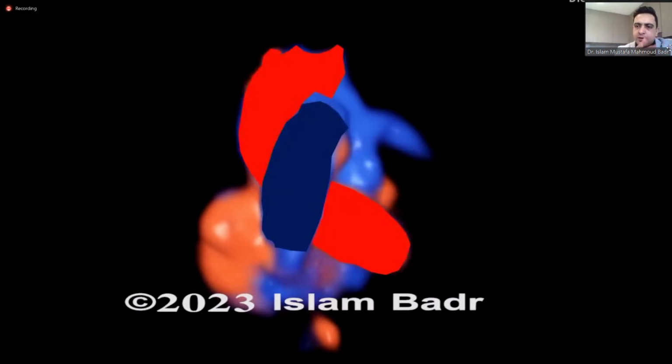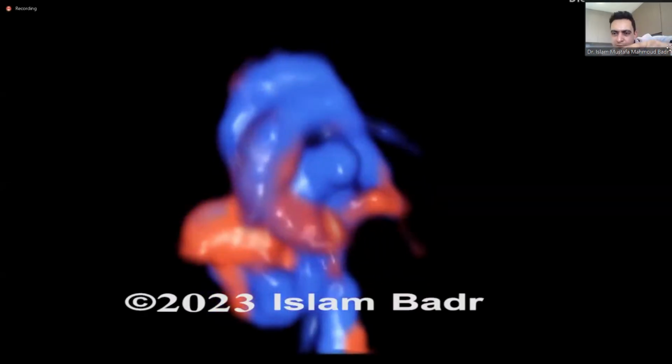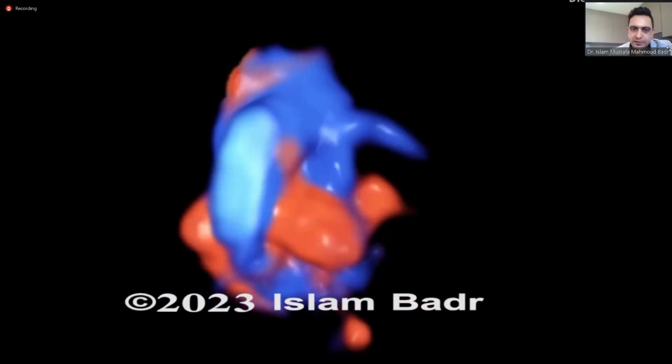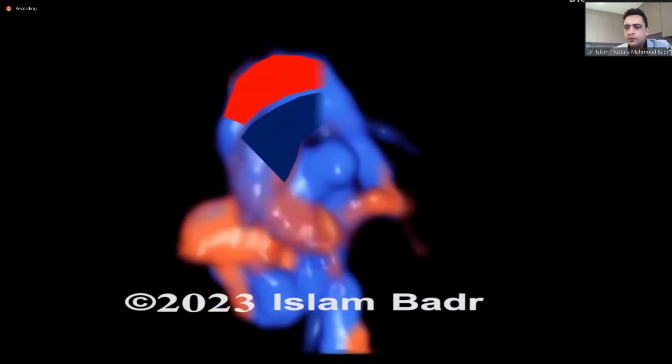Now we will start to see the heart from the lateral aspect. See what will happen? They both come to be parallel with each other distally. You will see the parallel connection now. I will label it. When you see this parallel orientation distally in a normal heart, what we call the V sign, don't misdiagnose this case as TGA, because you will have everyday normal cases misdiagnosed as TGA. This is just a V sign. This is just the parallel orientation of the great vessels distally where the aortic arch connects to the ductus arteriosus.